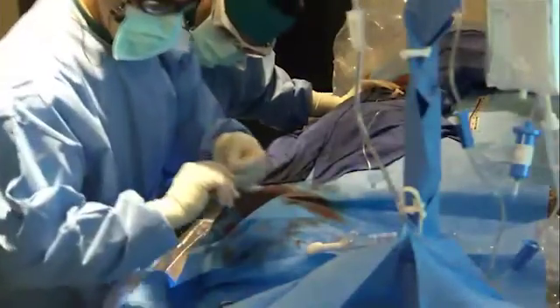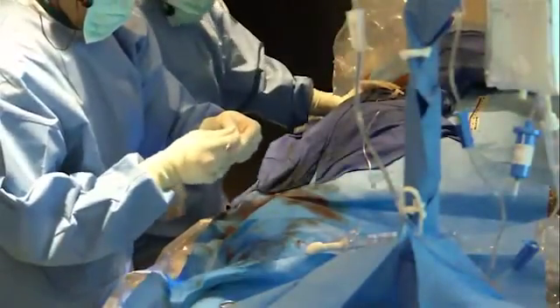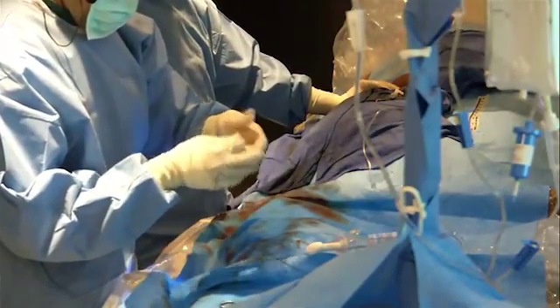So I have a question for Subhash while he's working with the wire. This case is such a great case to understand physiology, because with the whole issue of a covered stent in the SFA, the issue of an AV fistula is obviously really crucial. There was a question of whether there might be distal AV fistulas, which there aren't, but if there were, they actually, if anything, would enhance the chance of patency in the Viabahn.